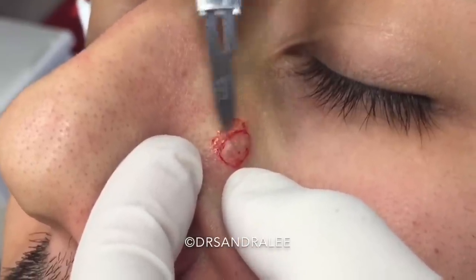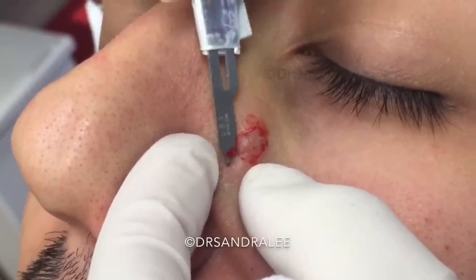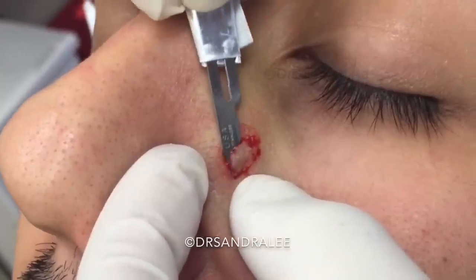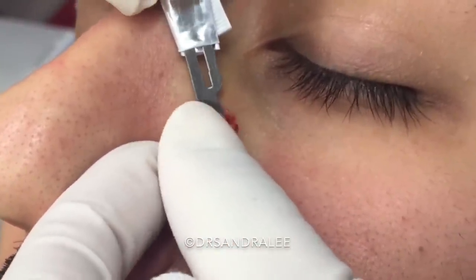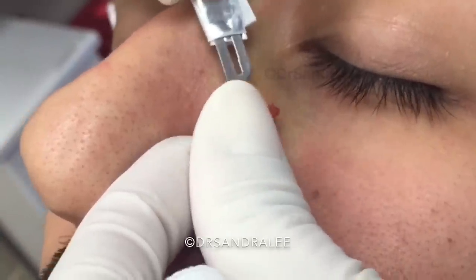It's kind of in a little bend of your face, like a little dip in your face, so sometimes I just got to be cautious not to take off too much. Sometimes I think we err more on the side of taking off a little too little. So if that happens, it's easy to remedy — we just try to take off a little bit more.